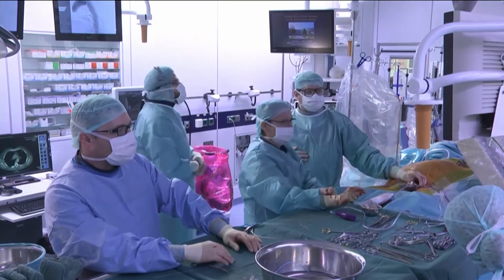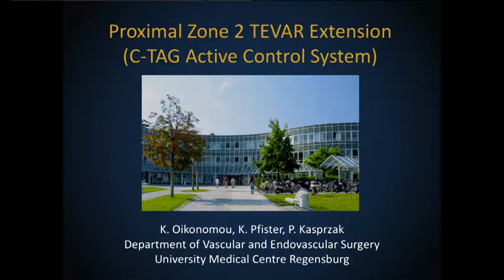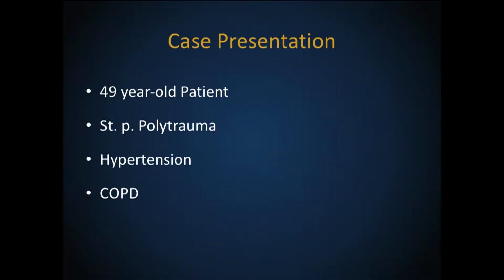Our first case is a 49-year-old patient who had a polytrauma in 2005. The patient suffers from hypertension and COPD.